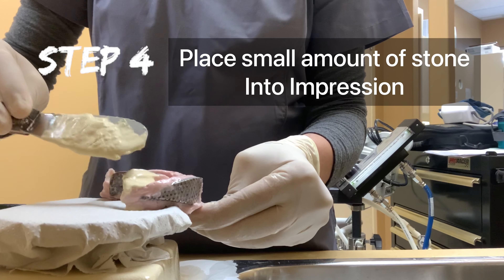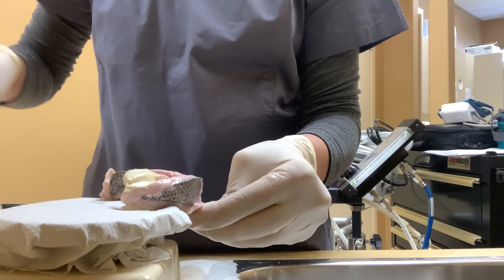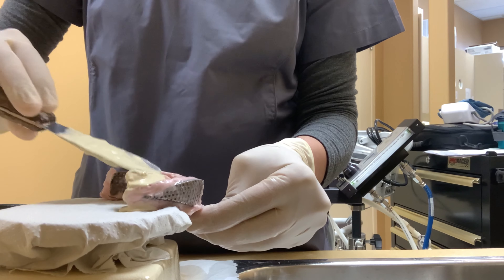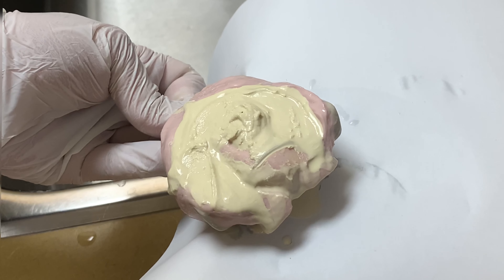Place a small amount of stone into the impression on one posterior side, allowing the stone to flow into the cusp and incisal edge of the teeth. Always add the next increment of stone at the same side — never go from side to side. Continue this routine until all the teeth are filled with stone.